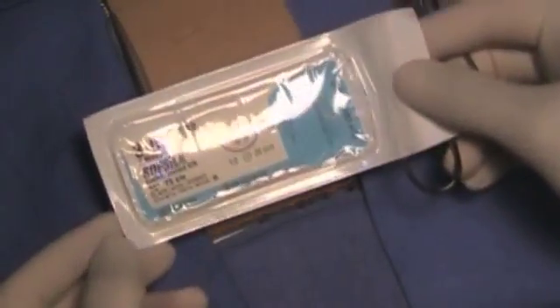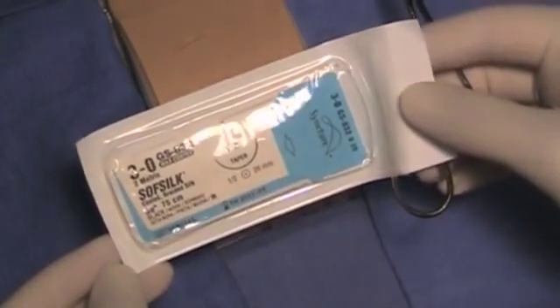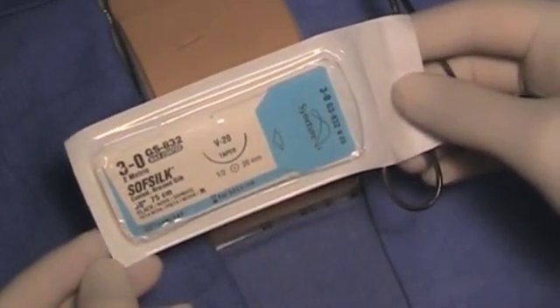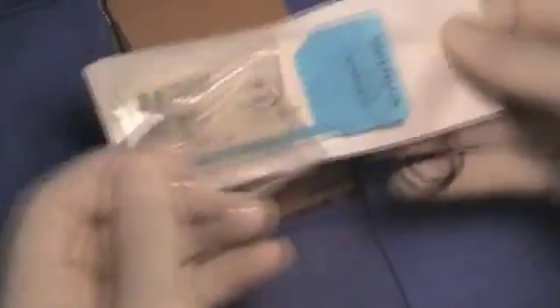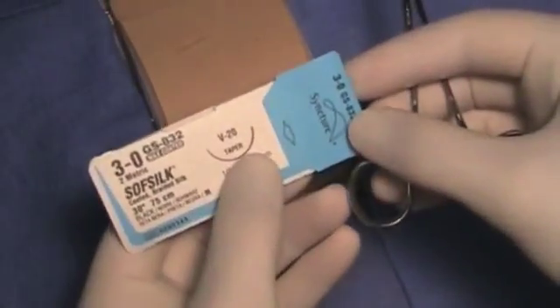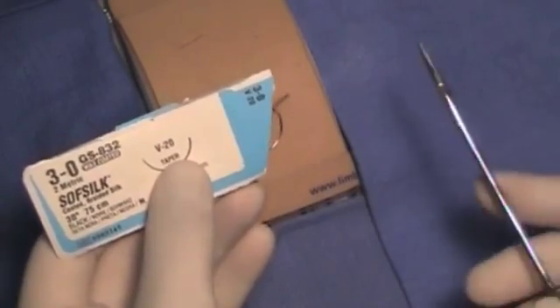Start with our suture material. We are going to be using 3-0 Soft Silk for testing and visualization purposes. The students will be instructed to and required to open up the packet and to load the needle into the needle driver correctly.